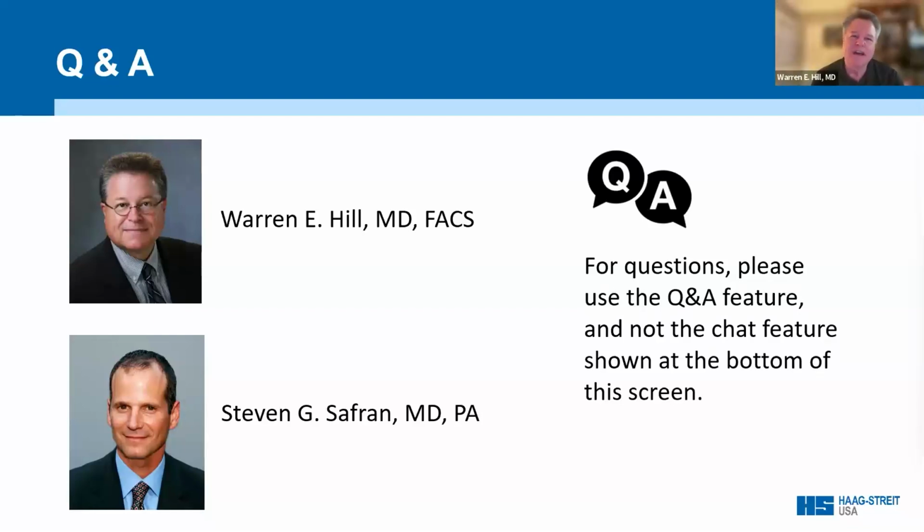Yeah, and I think for both Steve and I, the thought process begins with biometry, because as anterior segment surgeons, how are we judged by our patients and our peers? We're judged by our refractive outcomes. They don't care how perfect the rhexis is or whether or not our incision's exactly correct. They care about, am I minus a quarter, plus a quarter? That's what they care about. So the thought process really begins with biometry.